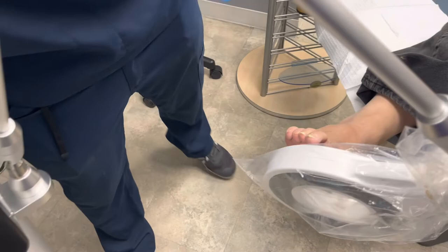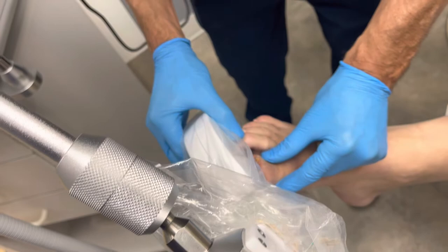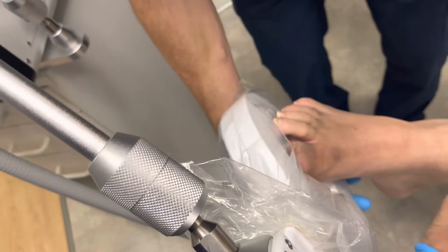We're going to get this so it's at the business end, right here. We're getting the maximum amount of magnetic field to his toe. I'm going to just bring this up just a little bit so we can actually get this right at the field area there. I'm not worried about it touching because we have a plastic bag. I'm just going to bring this up a little bit.